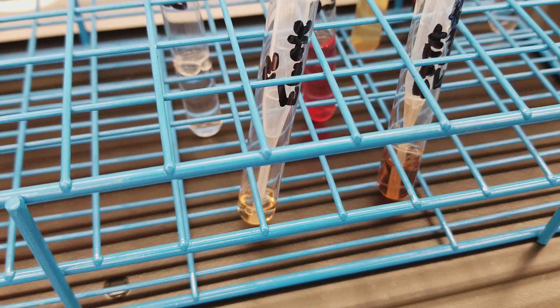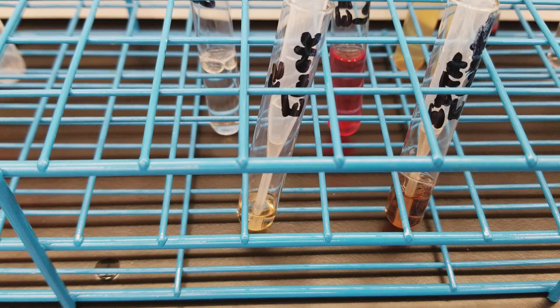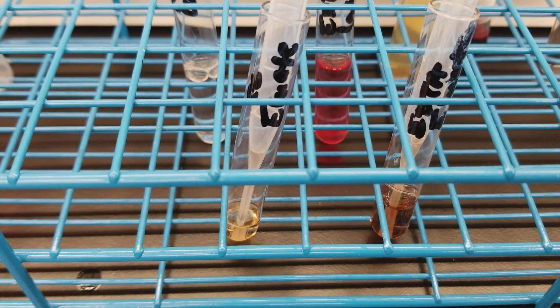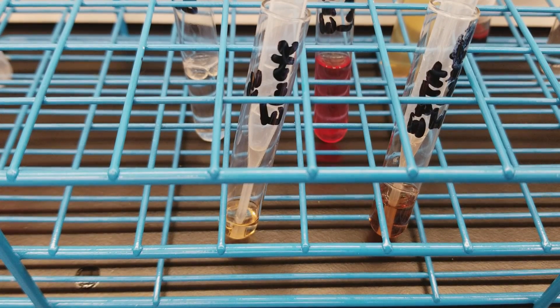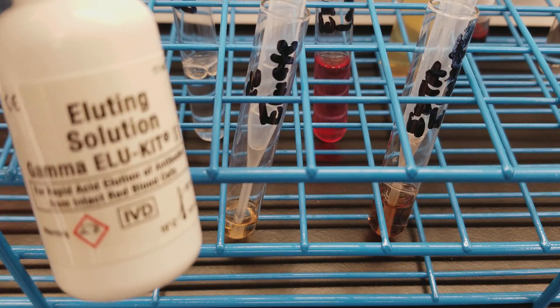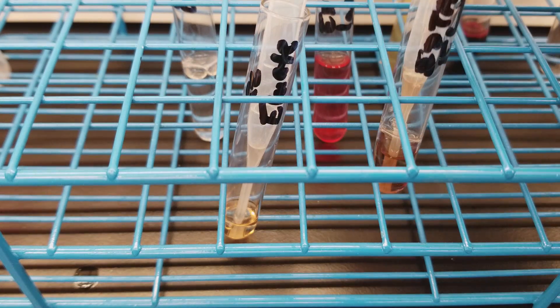Before we continue on, let's talk about what we've already done. We started out with our specimens, washed the red cells first with saline, then washed them with the working wash solution — a buffered solution. Then we added our eluting solution, which is the acid, in order to break the antibodies away from the red cell antigens. So right now what we have is an acidic eluate — the supernatant that we pulled off.